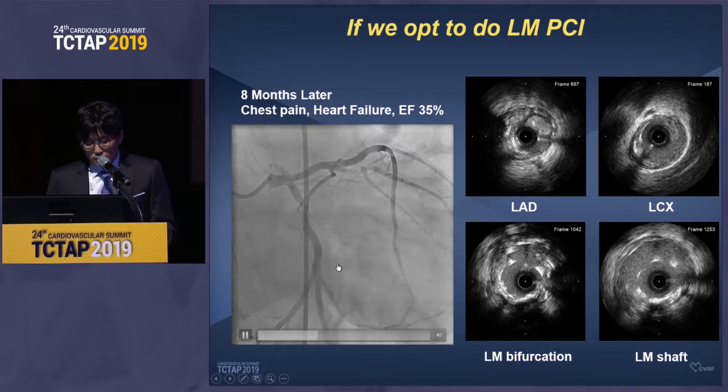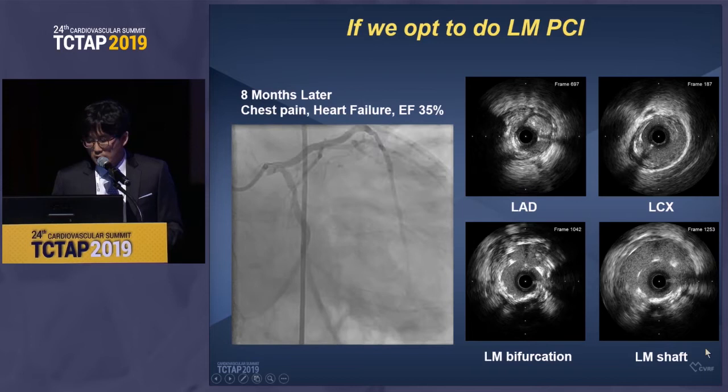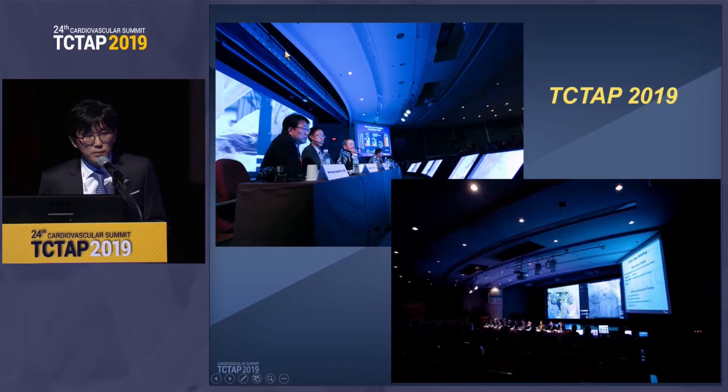So we did the imaging. There was a thrombus extending from the LAD and also from the circumflex to the left main bifurcation. There was underexpansion, and the stent was in malposition. So this is the key. If we opt to do the left main PCI, we have to do it right. I think this is what the left main PCI live demonstration of TCTAP is all about.